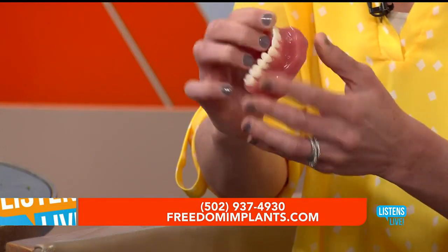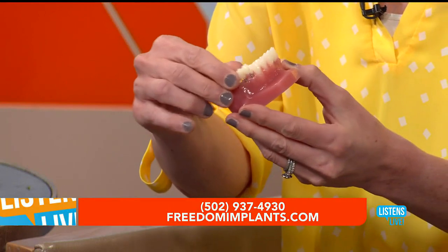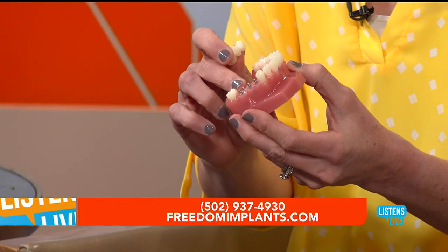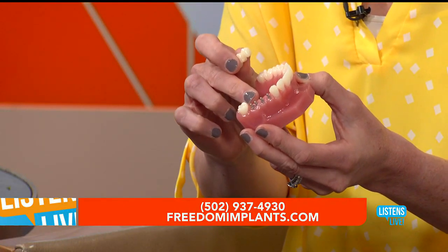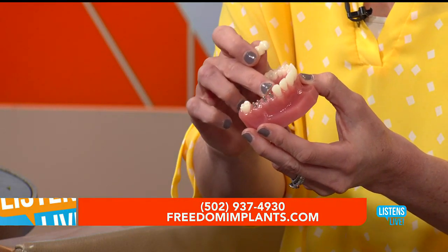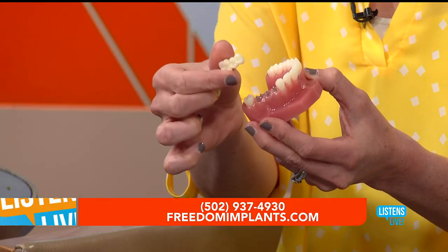So I can do 1 tooth, or a lot of people are missing maybe their molars in the back. I like to call them your big chewers, and you really want more to chew with. This model's showing missing 3 teeth. Same process, just numb you up. I'm just going to place more implants. You'll leave with the temporary and come back about 4 weeks later for the permanent bridge.